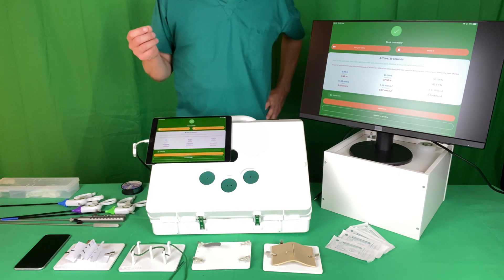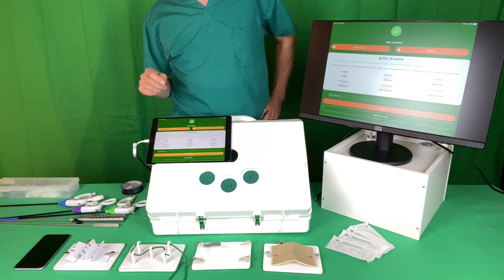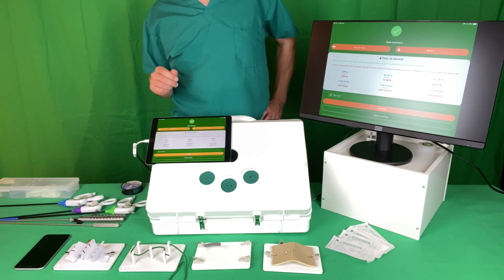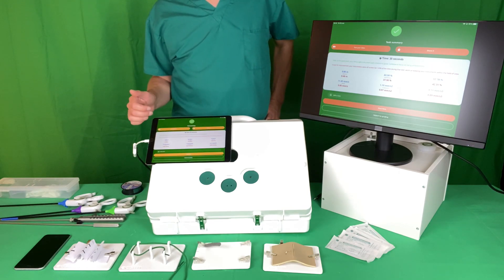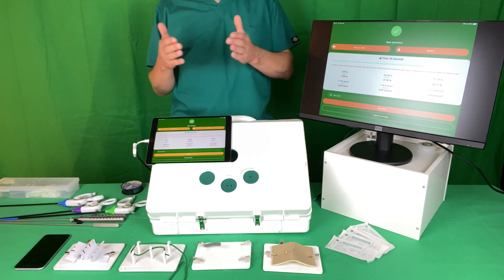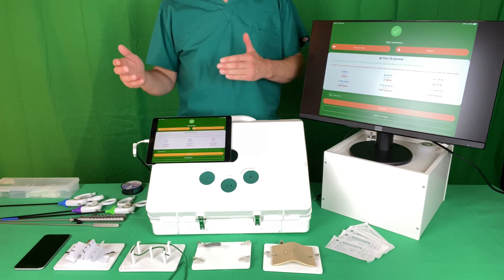Those numbers in themselves don't necessarily mean a great deal on their own — they do allow you to map your progression over time — but because they don't individually help you, we've added a degree of natural language processing. So there are two lines here that talk about the percentage of time that your instruments were on or off the operative field and the ratio of one hand to the other.